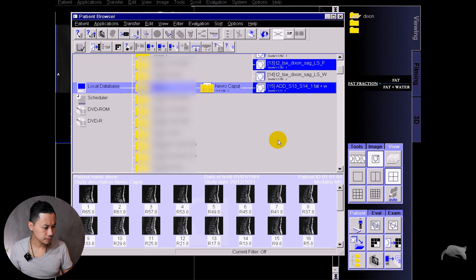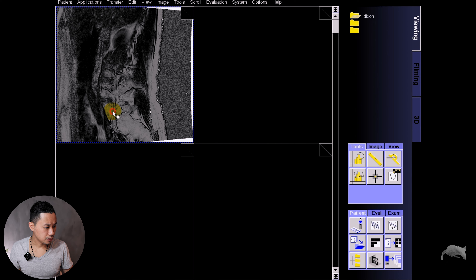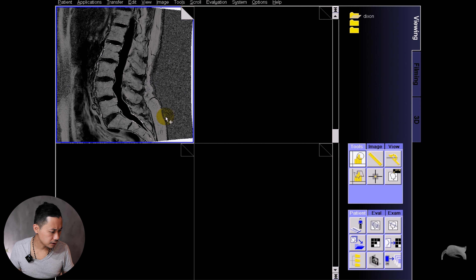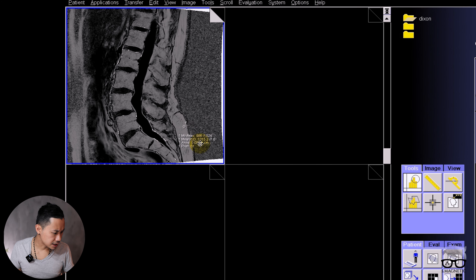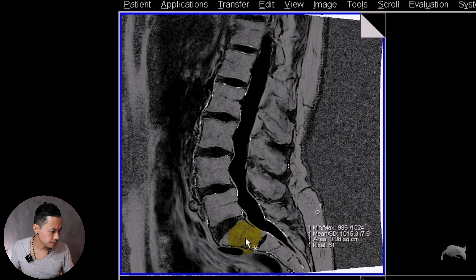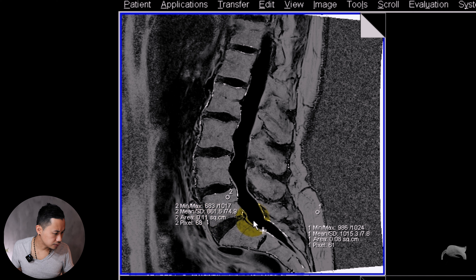Then we're going to do a test before we put Apply — I just choose a middle slice and do a test to see if the images come out as I wanted. It seems perfect. Then I put OK and drag and drop the sequence into the viewer.